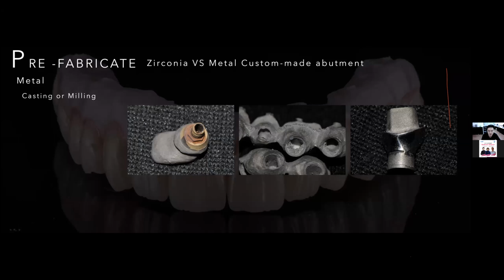Many technicians have probably met this situation: you lose your gold abutment or casting abutment and need to buy it again, because this needs very high, very sensitive technology. Even I don't do it very well every time, and my staff sometimes make mistakes like this. So I think this is not a good decision and not a good choice.